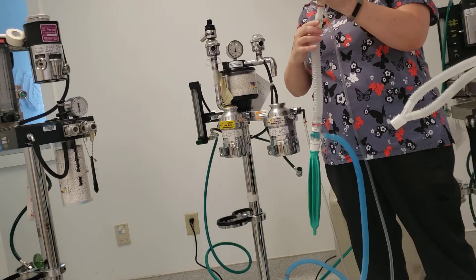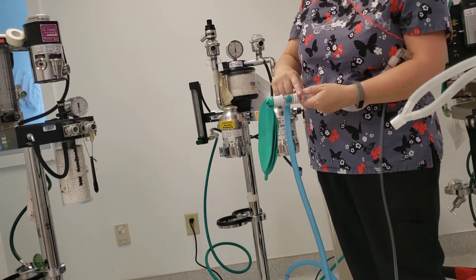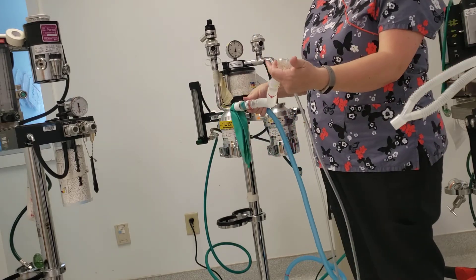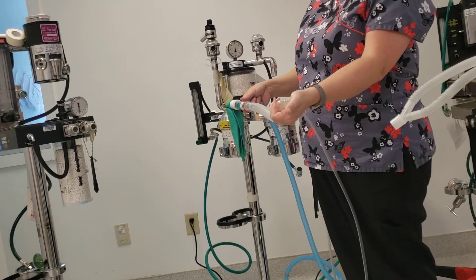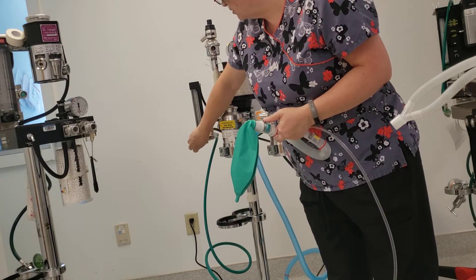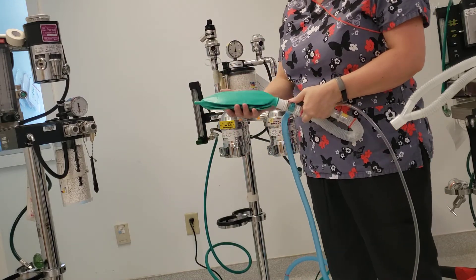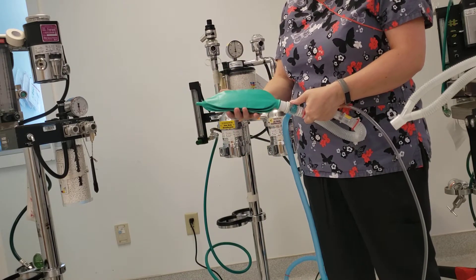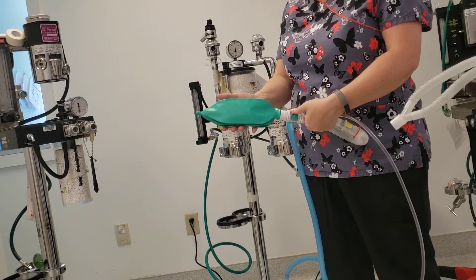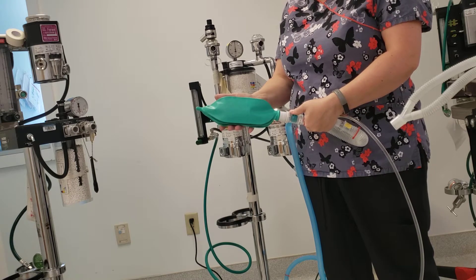If you want to leak check this system, this is the pop-up valve for your non-rebreather. You're going to close it. You're going to put your hand over the patient end and turn on your oxygen. We will not have a manometer to watch — we're just going to watch and make sure that we can give a breath to our patient. I'm going to wait until it's full or semi-full, since I don't have a manometer to actually check.